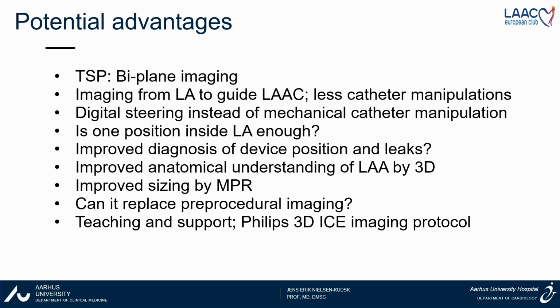I also expect that by putting this catheter into the left atrium, we can avoid many of our current catheter manipulations to do all the views. We can use digital steering instead of mechanical steering. And I'm really excited by the possibility that we might position the catheter in just one mid-LA position, and from there you can get all your views.